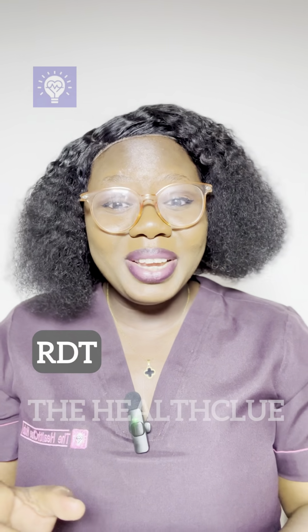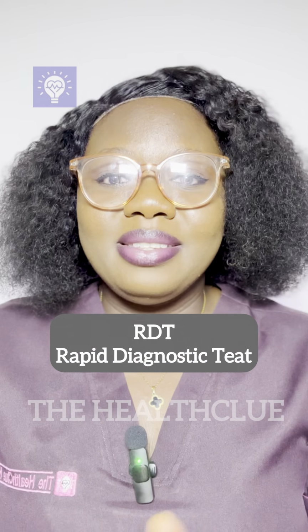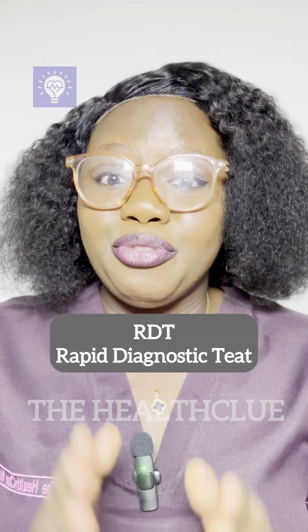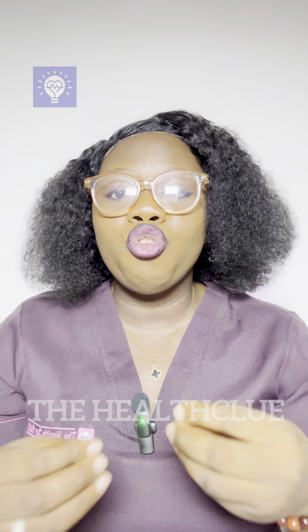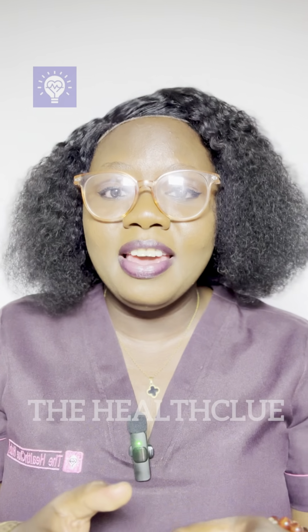Let's talk about RDT versus microscopy in malaria tests. RDT means rapid diagnostic test for malaria. It's a situation where if you go for malaria tests, they use a cassette to run the malaria diagnosis. So what happens is they take a drop of blood and check if you're malaria positive or malaria negative, more like looking out for either a single line or a double line.